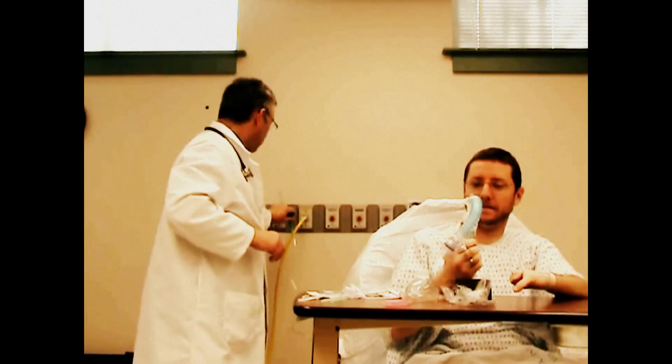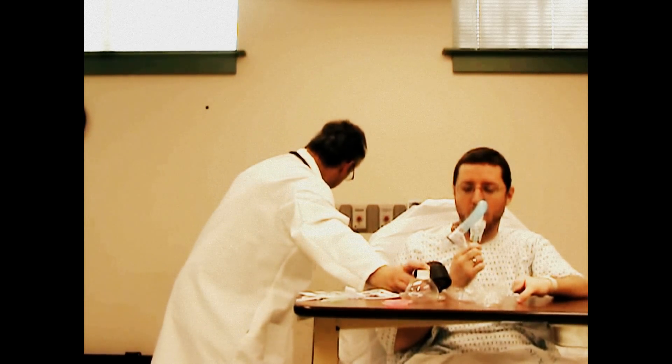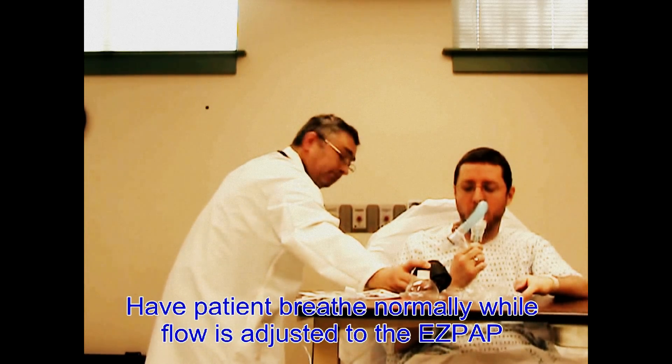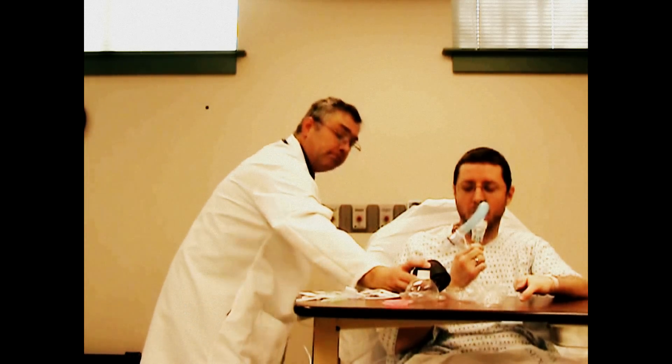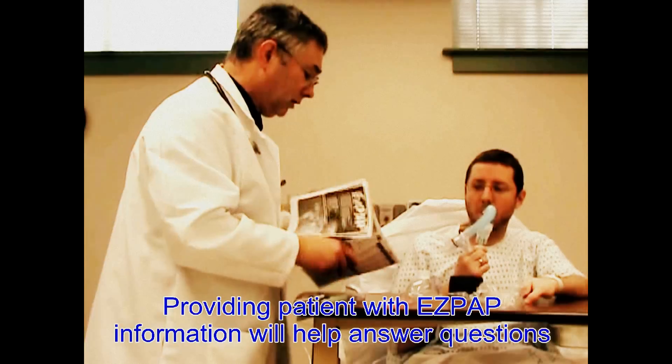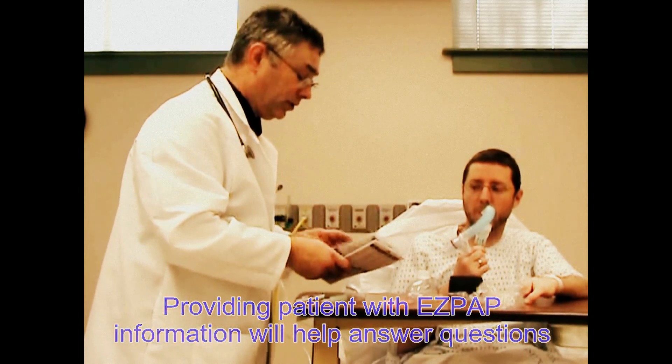As soon as I turn it on. I'm going to start turning up the pressure that you'll feel. I'm giving you about five pressure. This little pamphlet here will explain a little bit how this works in the event we send you home with it.